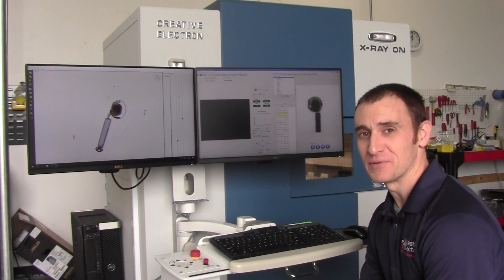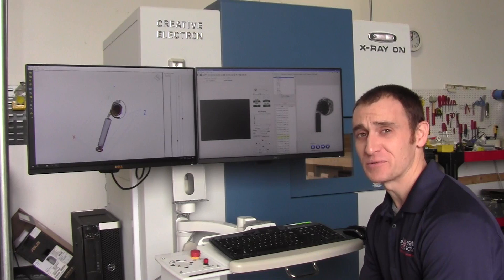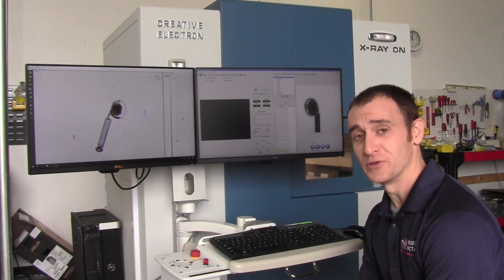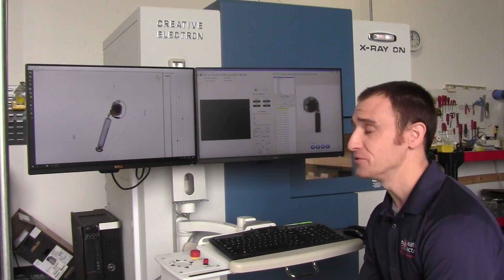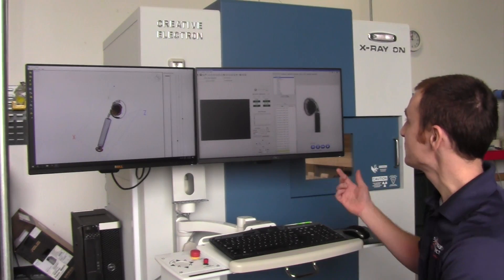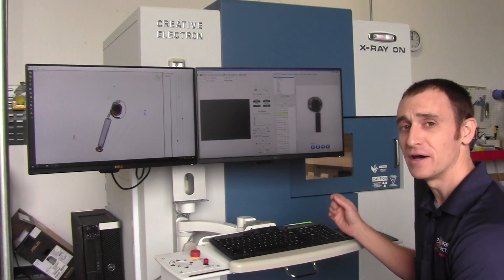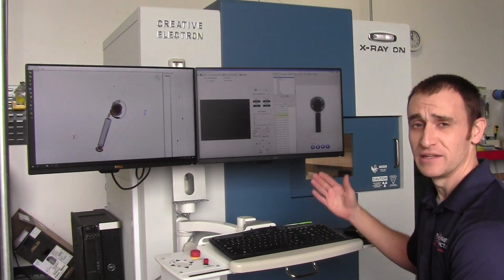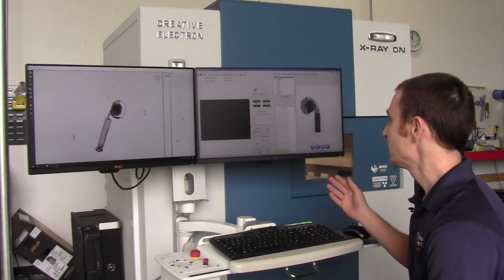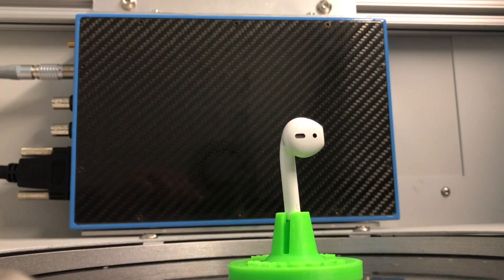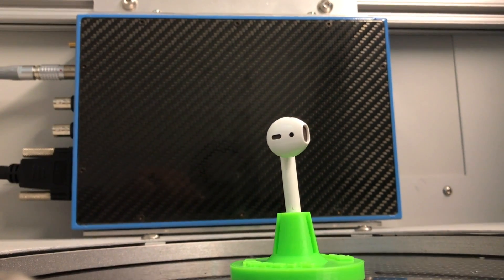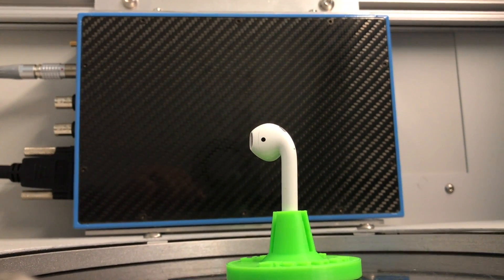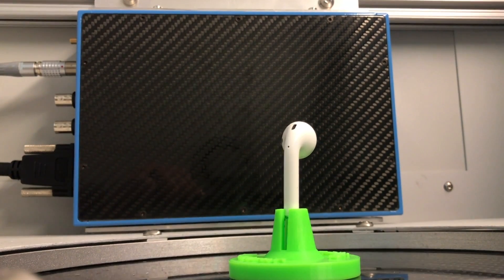Now that we have our CT system in place, the first thing we need to do is take our x-ray images in order to build the CT volume — the model. We have an Apple AirPod inside the system. We take our x-ray images, and in this case we have 900 images, and you can see it rotating, showing image after image of the AirPod rotating inside the x-ray system.